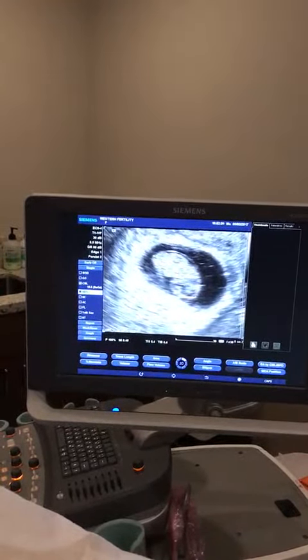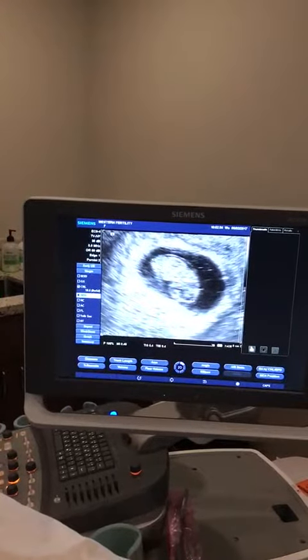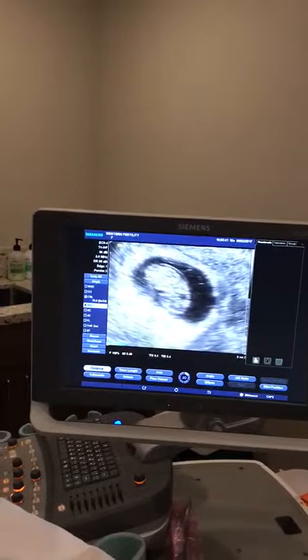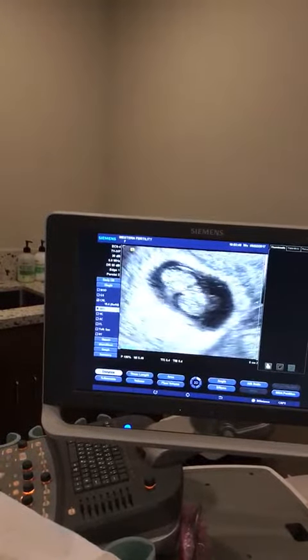And you're eight weeks and four days, and your baby measures eight weeks and five days, so it's a perfect spot. It looks like the perfect shape of the fetus — looks like a textbook, doesn't it?